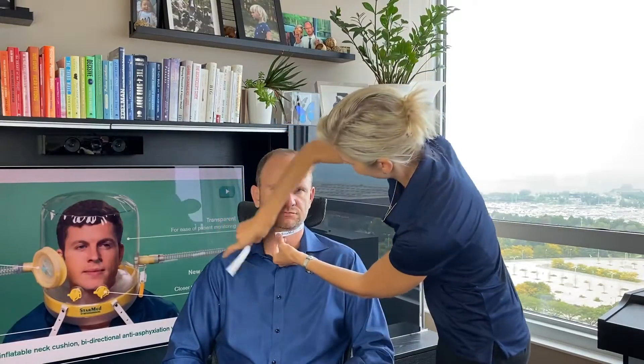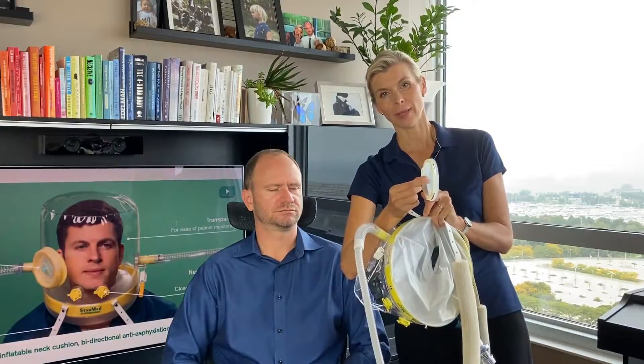Here we have our patient who will measure his neck first. The size he will need is large. Take the large size helmet, make sure you connect your flow, your filter, and the PEEP valve. In the back of the helmet, attach your underarm straps. Also remove the patient access port — make sure it's open. Check for the anti-asphyxiation valve; this valve should move back and forth when you pull. Have your bulb ready so you can inflate the pillow.